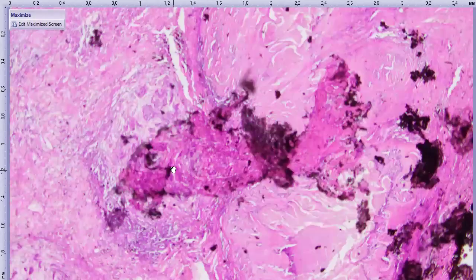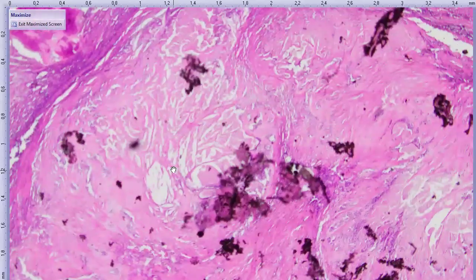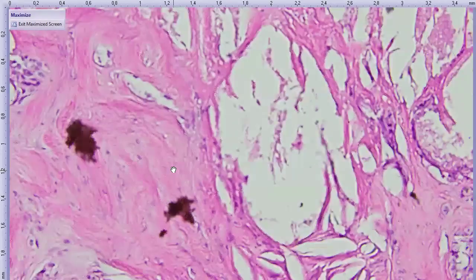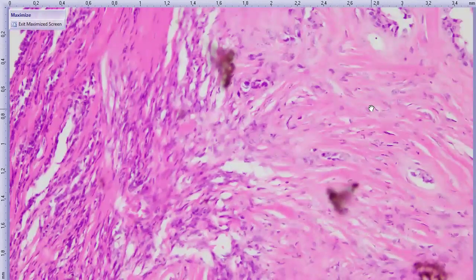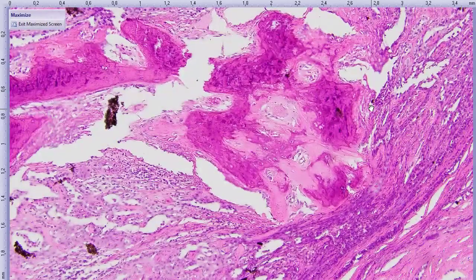Okay, then we start looking around. Very necrotic. This tumor is doing weird things. There are areas like that where there's this dense eosinophilic extracellular matrix. It looks like collagen, but it's flirting with maybe a basement membrane, maybe an osteoid matrix, like these guys are producing osteoid, but you can see how linear that stuff is. So let's keep that in mind. You move around and the maybe osteoid becomes obviously osteoid.